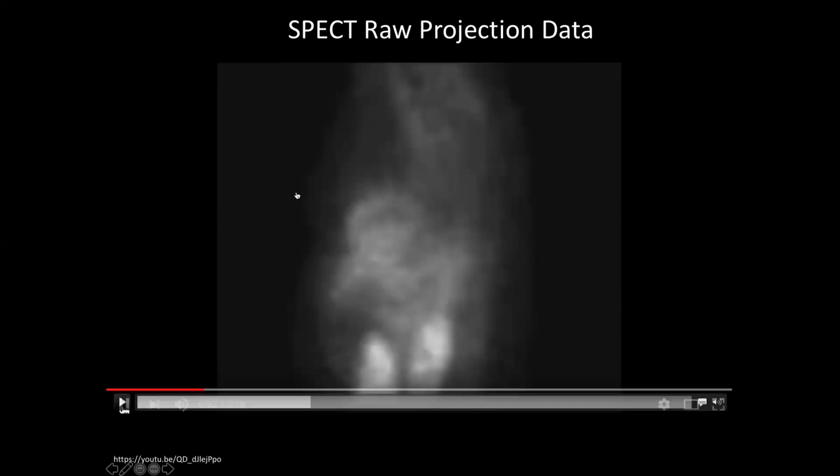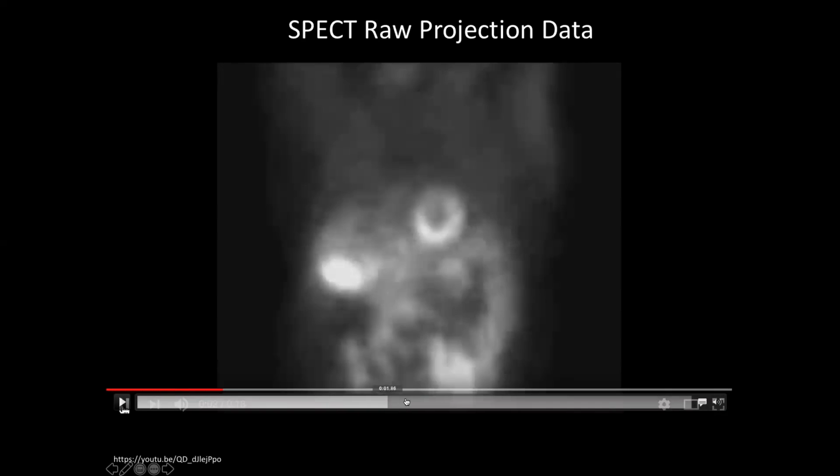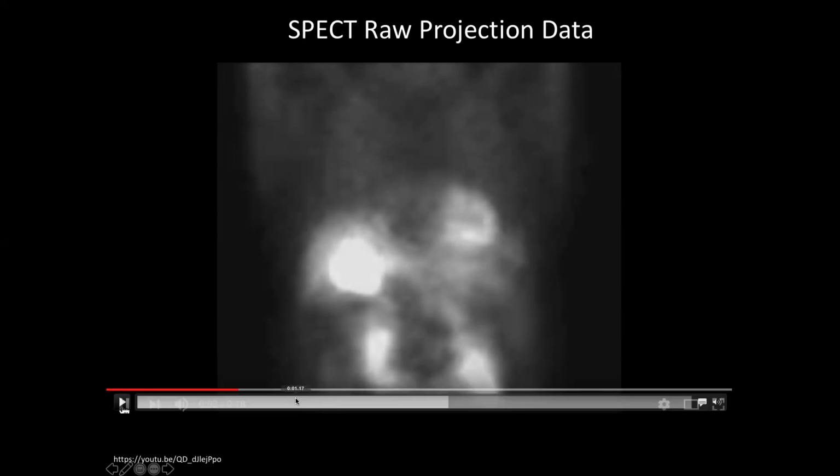Their chest is here and their back is here. So when I rotate up to look completely from the anterior view right down through the patient's chest, we can do that by rotating our detector to that coordinate. Right now we're looking from the top of the patient down. We're going to do that over 180 degrees. Look at all the views of the patient. Okay. Is that clear what the coordinates are there?